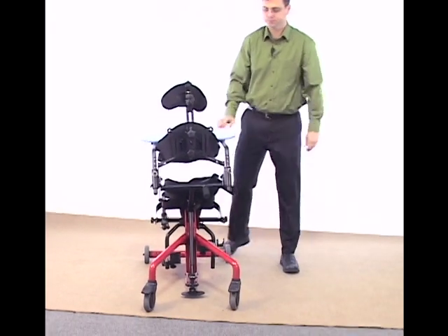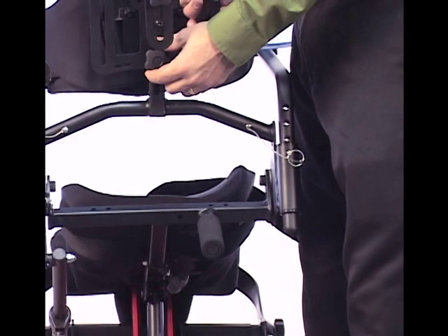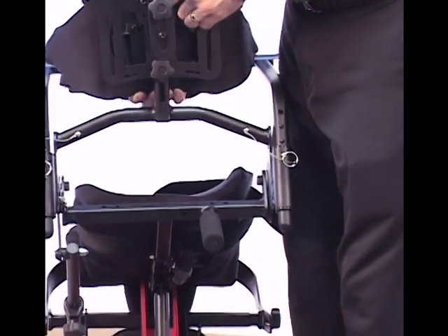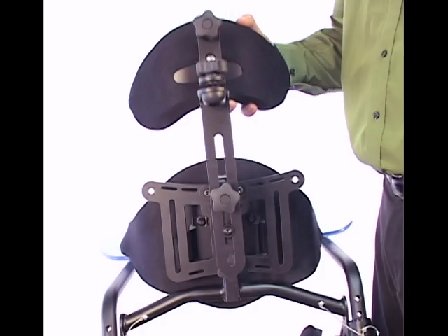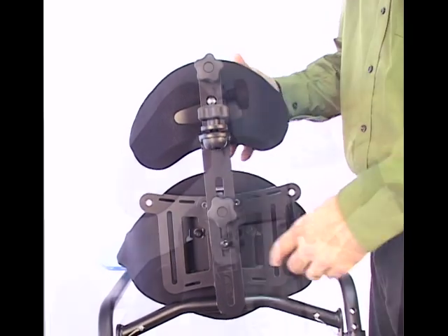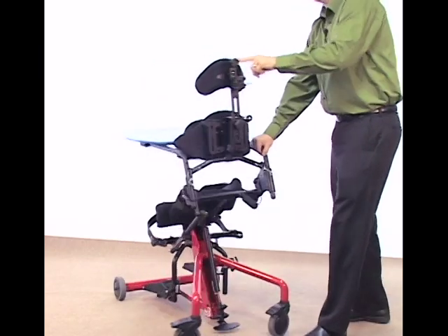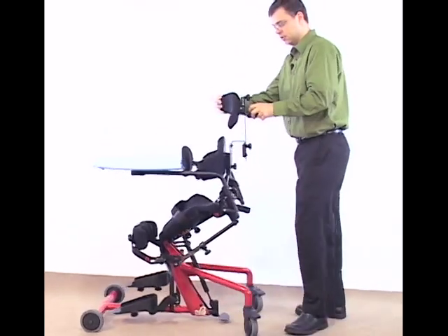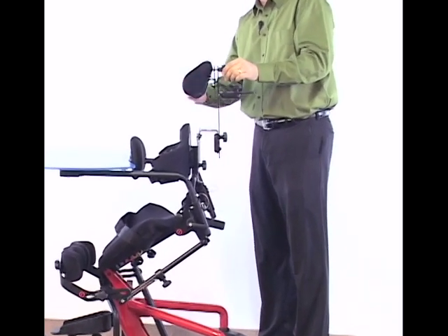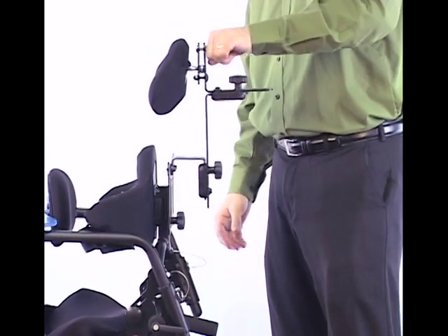Now let's take a closer look at setting our back and head adjustments. The height of your thoracic support or back can be set by loosening the knob and raising or lowering the back support. In addition, there's support for head support height and head support depth. The knob on top of the unit allows for angle adjustment of the head support — you can adjust for up and down, or on a ball swivel so any desired adjustment can be made for the head support.